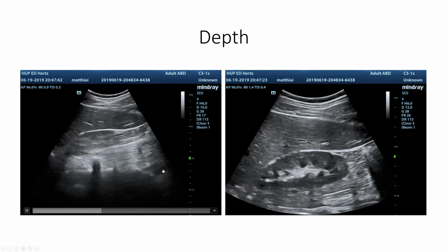When you're in a rush or when you're a new learner, it just really tends to be the case that you forget to adjust the depth, and to compensate for that, you really squint and bring your face really close to the machine and maybe barely can see what you want to see. But an optimized depth is going to really take you far, and is probably the knob that you're most needing to adjust and most likely to forget to adjust.